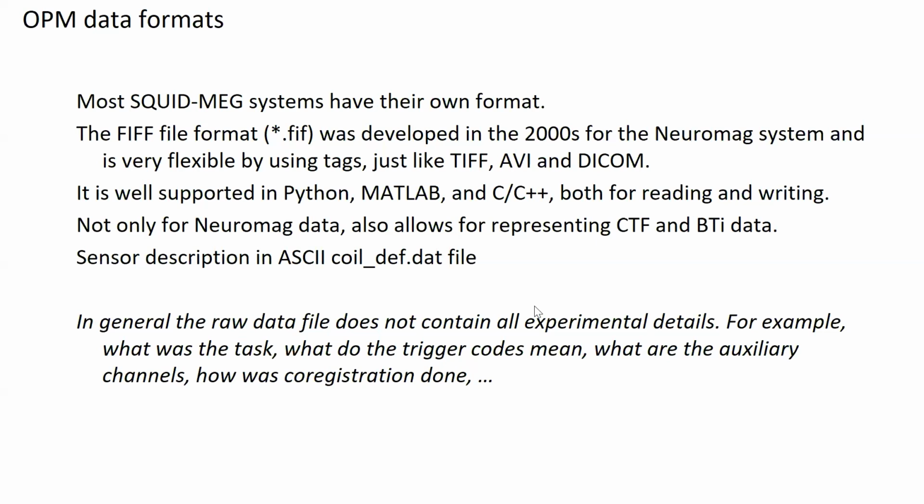So I'm hoping that OPM vendors are going to adopt the FIFF format because we already have the support for it. The FIFF format we already know for a long time. It not only works for Neuromag data, it also allows for representing data from other SQUID-based MEG systems such as CTF and BTi. And the FIFF format allows for a very detailed description of the sensor, so the spatial extent of the sensors, and for OPMs we also allow for modeling the spatial volume of the sensors in a separate coil definition file.